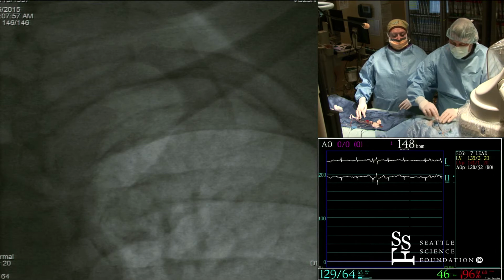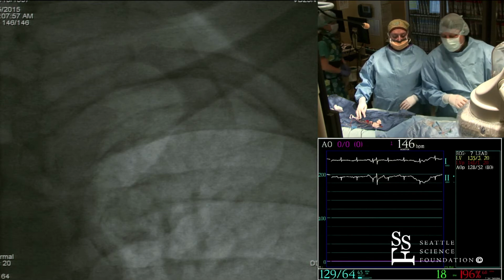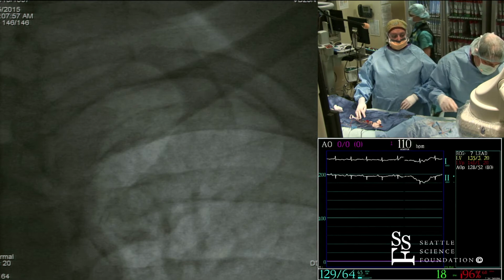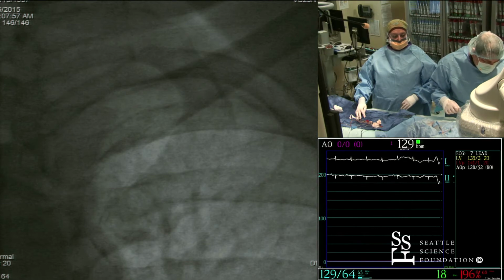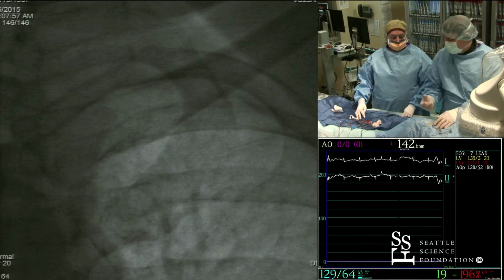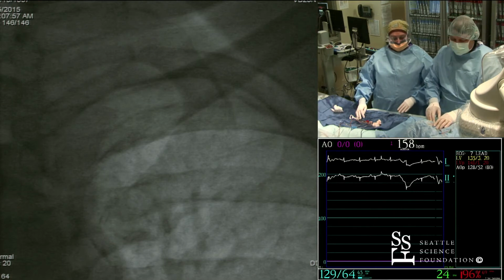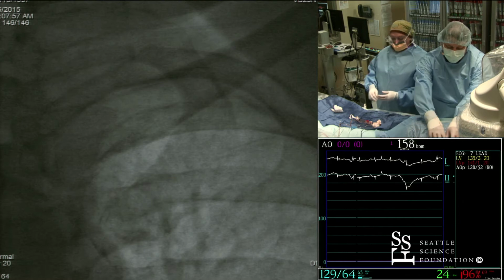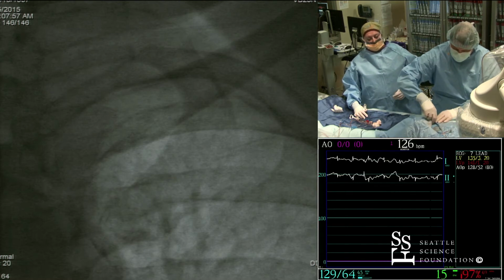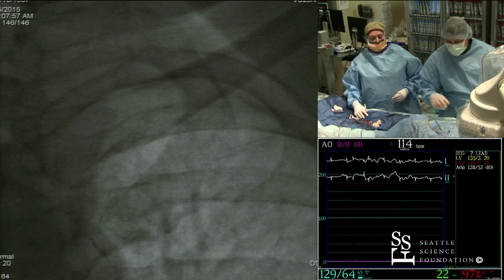Okay, so we're all done here. I don't think anybody feels like there's anything they really want to do. Things look good. We're going to get this thing out of your wrist here in a moment, okay? All right, good. So I'll show you how we have lately been using the TR band as our standard go-to here for closure of the device. And we break open this 3M thing here, and we're going to lay his arm down by the side, and we'll show you that.